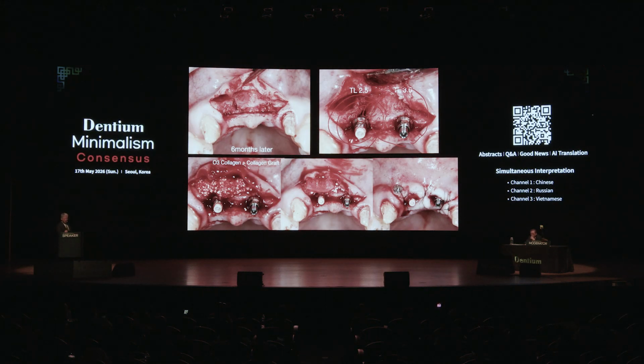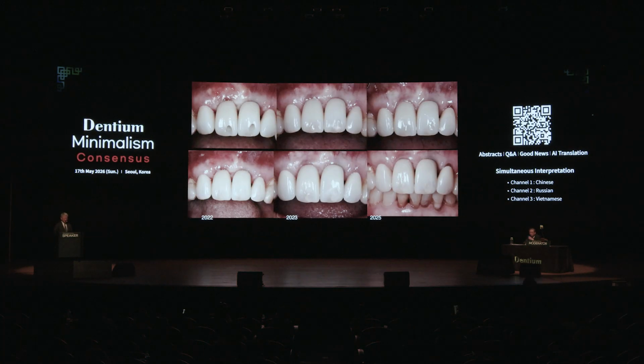Also in these areas, when you evaluate the bone, it is around 1 millimeter. Usually the ideal remaining bone on the labial side is recommended to be at least 1.5 millimeters, sometimes 2 millimeters. For that, we must do additional augmentation on the labial side. But with the narrow diameter, the concept of the ideal labial bone becomes different. After the final processes at that time, with the collagen graft, there was a little more thickening on this side.